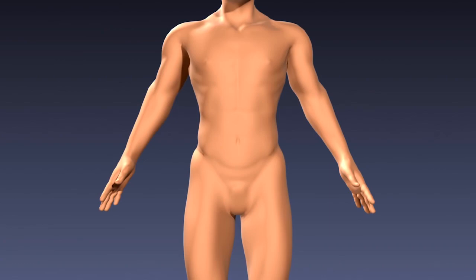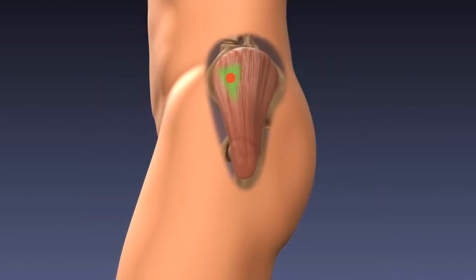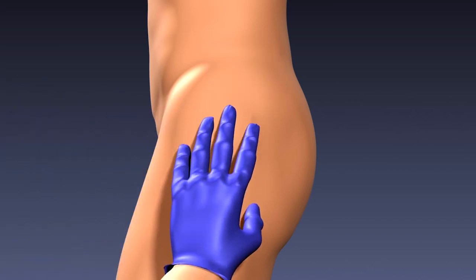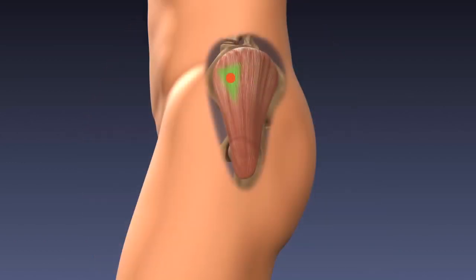Select an appropriate site for the injection. The vastus lateralis and the deltoid muscle are possible sites for IM injection, but the ventrogluteal site is preferred. Examine the integrity and amount of the patient's muscle mass and palpate the muscle. Areas of tenderness or hardness are not suitable injection sites. If the patient receives frequent injections, rotate the site selection.